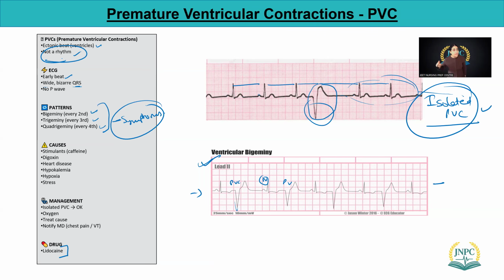So every time I say cardioversion, make sure that you turn on that synchronize button on the defibrillation machine so that we can deliver a small amount of electric shock. Okay. So other than that, lidocaine can be the choice of drug.